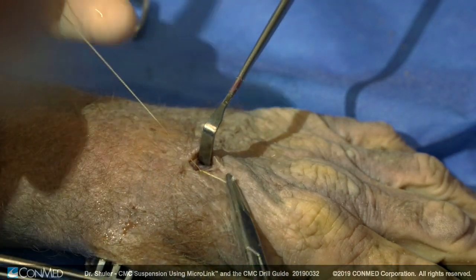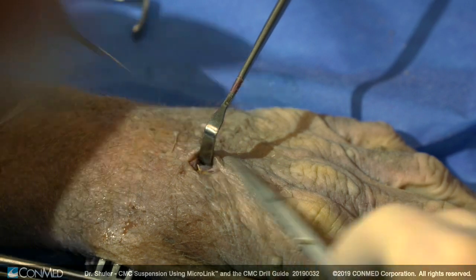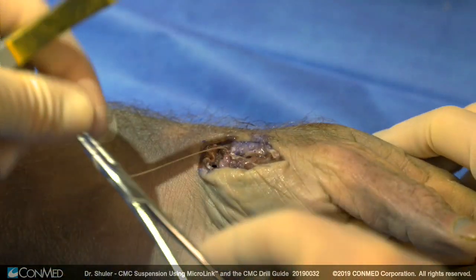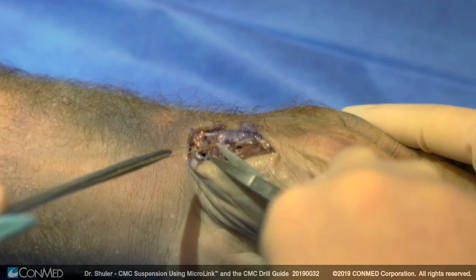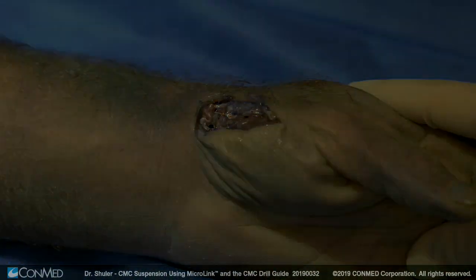Lastly, the capsule is closed using a Vicryl suture, and skin is closed using a 4-0 nylon with simple sutures. The wound is dressed with Coban, 4x4 gauze, and a thumb spica splint is applied for approximately two weeks, after which active mobilization is performed under the care of occupational therapy.